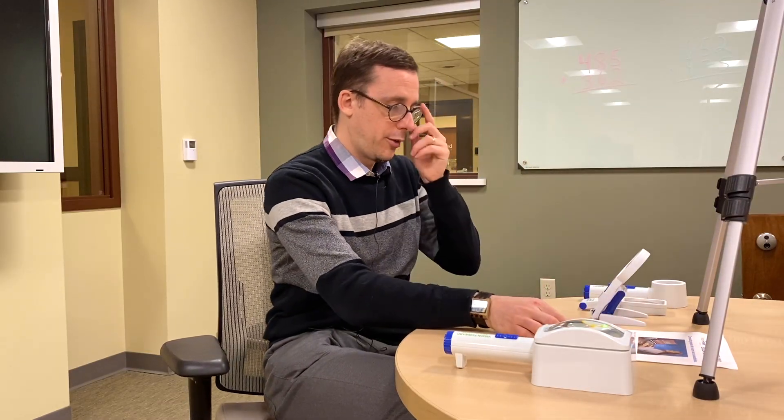Both of the magnifiers we just looked at have lights built in, and lighting is very important when it comes to magnification. It can really aid in helping you see what you're trying to read. If you're going to buy a magnifier, you'd want one with an LED light built in — they're nice and bright, don't use too much power, and don't get hot. You could also use an external task lamp on a table or standing on the floor next to where you're working.